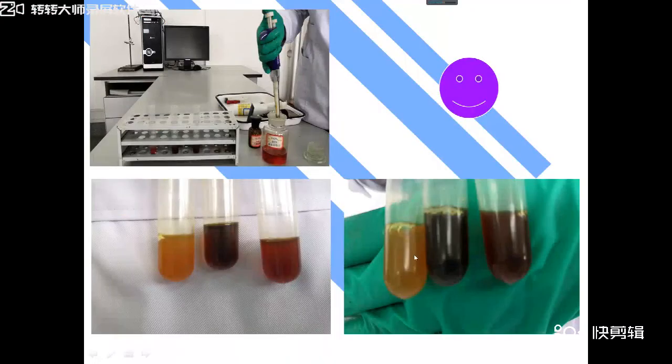Just now we have done the lab. We know the different colors of different tubes, and in accord with the color, we can know the activity of cholinesterase. It means yellow is high activity. Dark means low activity. Between them, because we use PAM chloride, we use a cholinesterase reactivator.